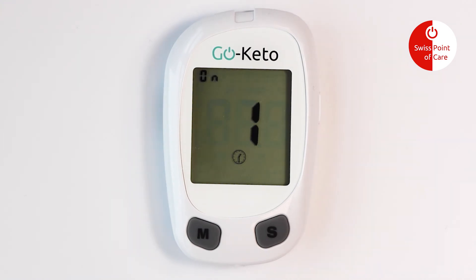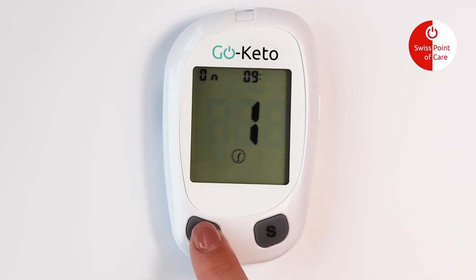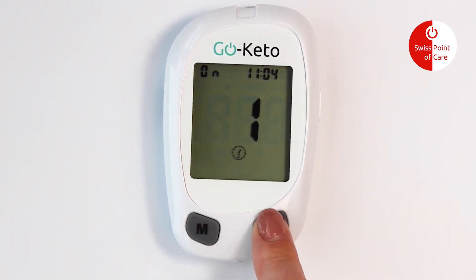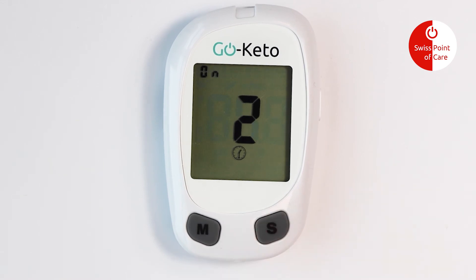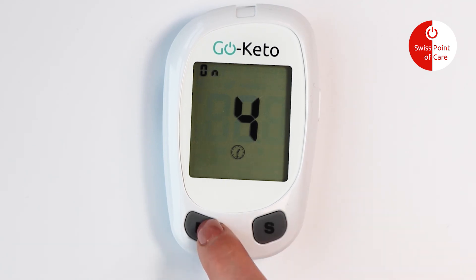Press the S button to switch the test reminder on and off, then press the S button to confirm your selection. When the test reminder is on, press the S button, and then press the M button to adjust the reminder time. Press the S button to save your choice. You can set 1 to 5 reminders per day.